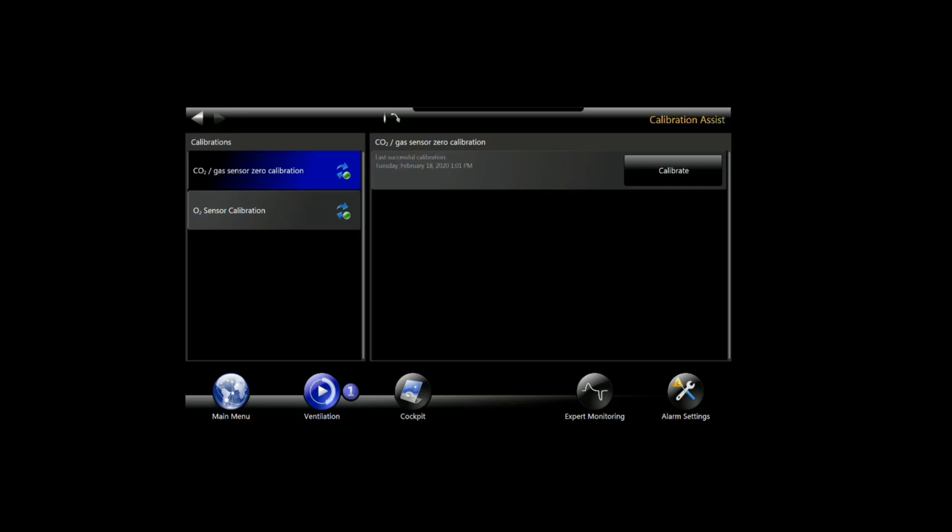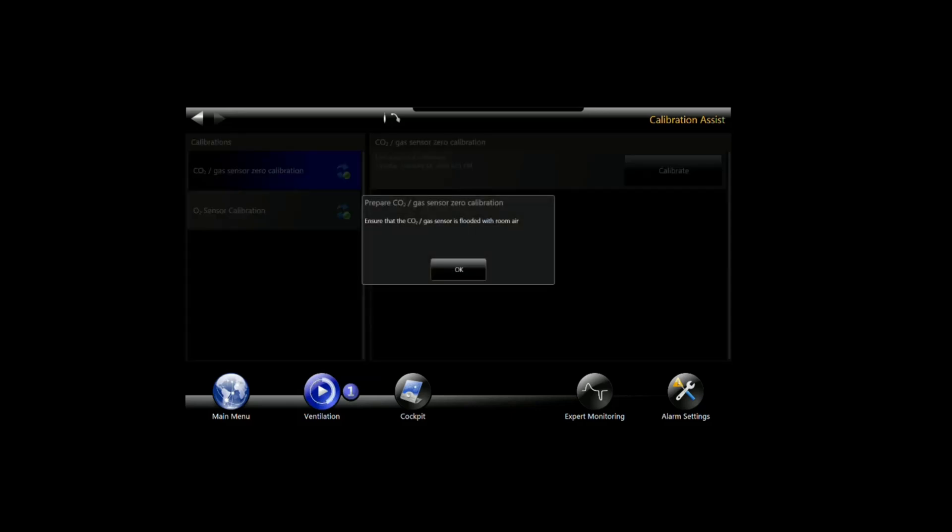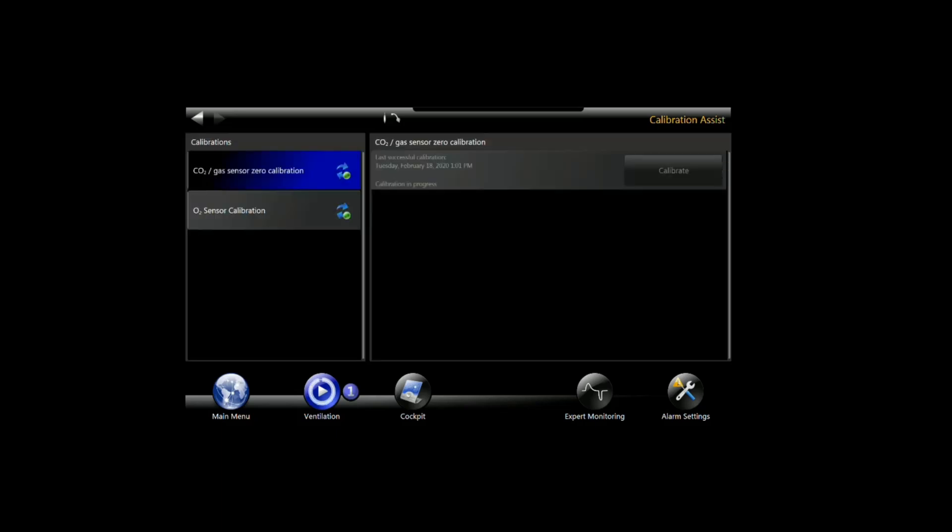Then just hit the calibration button. There's a confirmation step, and it's done. You'll see that once it finishes the calibration, it updates with the current date and time.